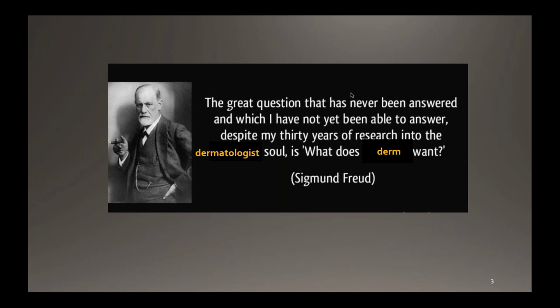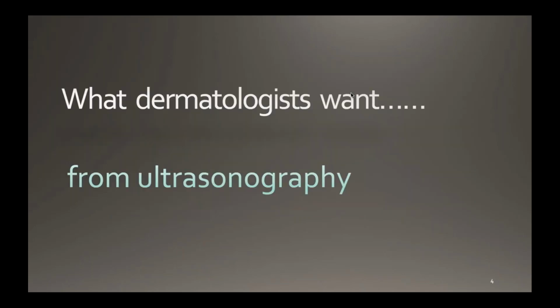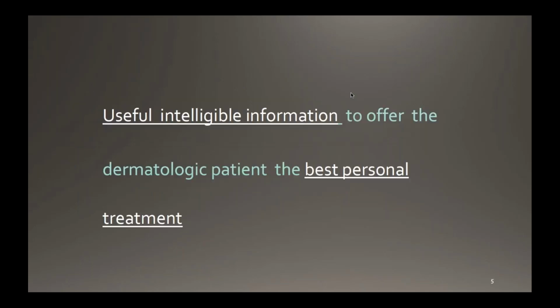That's an important question, because if you know what is in the head of the dermatologist, you can offer what they are asking, even if they don't know what they require now. What do they really want from ultrasonography? This sentence summarizes what a dermatologist may need regarding dermatologic ultrasound from us as professionals doing ultrasound.